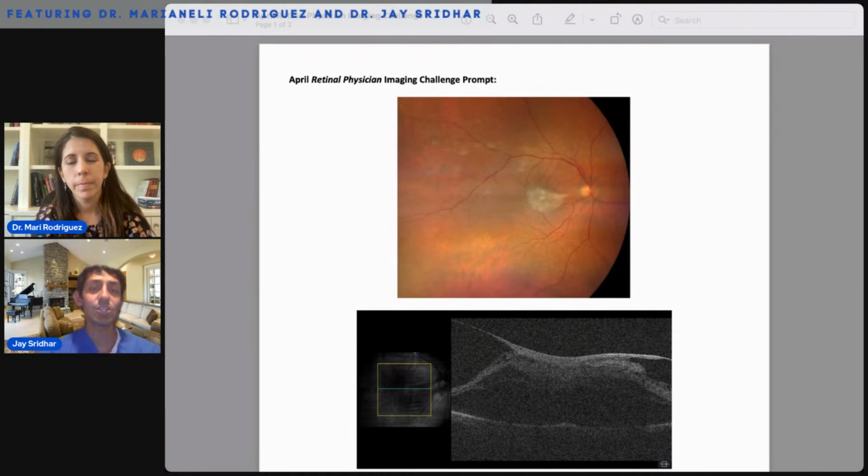In the past, people used to have strict vision cutoffs, similar to cataract surgery, where they said, if your vision's not worse than 20/40 or 20/50, don't do it. But with modern vitreoretinal surgical techniques and better imaging, we understand that you can have a 20/40 patient with an ERM where the ERM is not the reason for the 20/40 vision, and maybe you shouldn't take them to surgery. And you could have a 20/25 patient with an ERM who can see the eye chart, but has significant distortion, significant metamorphopsia, and the ERM is the causative issue.